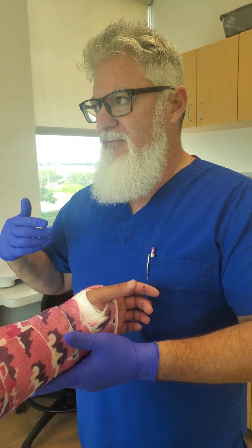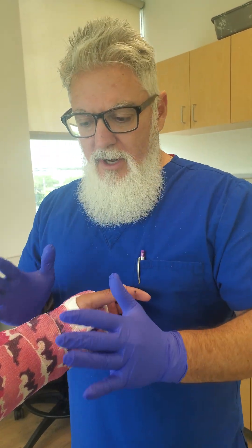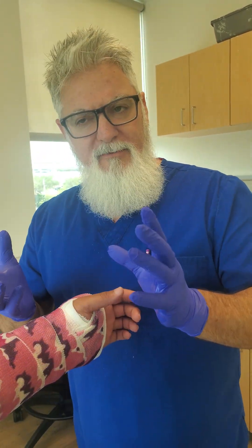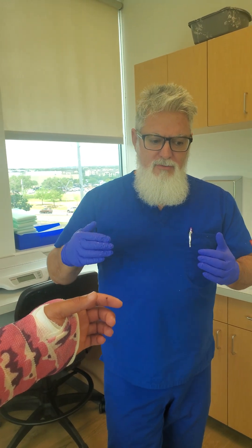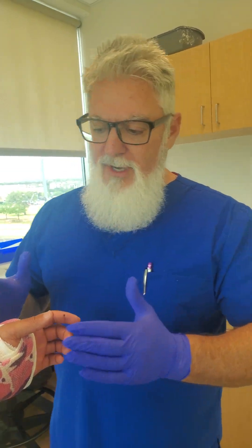So we're going to do a few — maybe four or five upper extremity short videos on different molds that are requested by the providers. And we'll do in that series later on two or three or four videos of the lower extremities and those molds that are most requested.